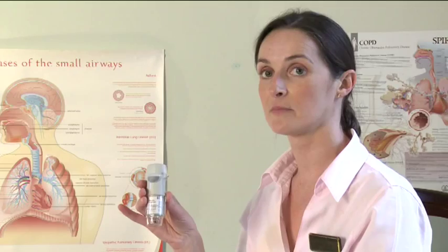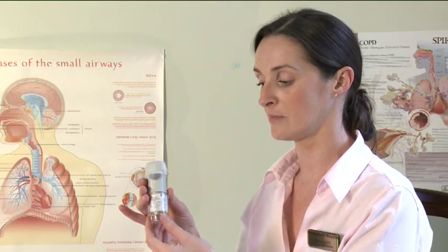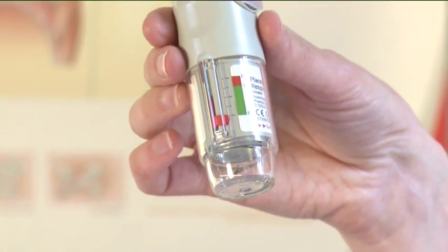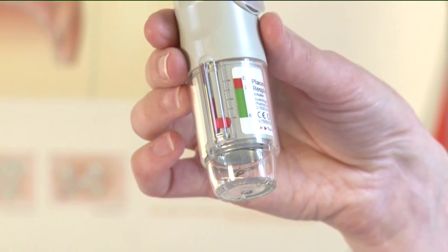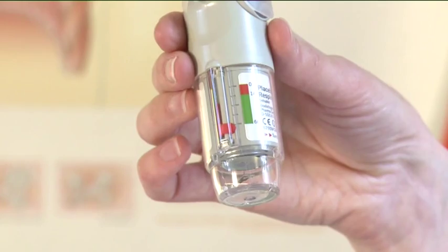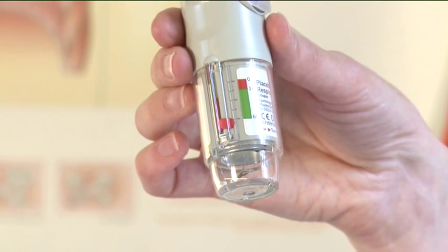When to replace your inhaler. The Respimat inhaler has 60 doses. There is a counter on the side of the inhaler. When the counter enters the red area of the scale, there are approximately 14 doses left. When the counter reaches zero, replace your inhaler.